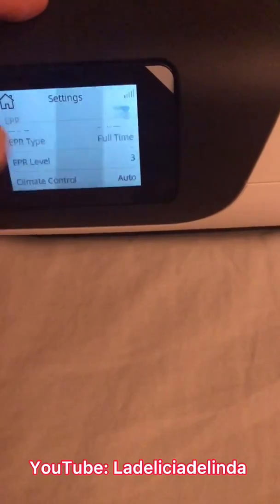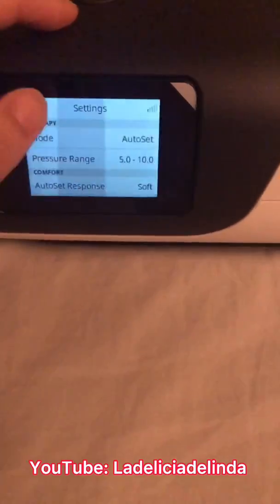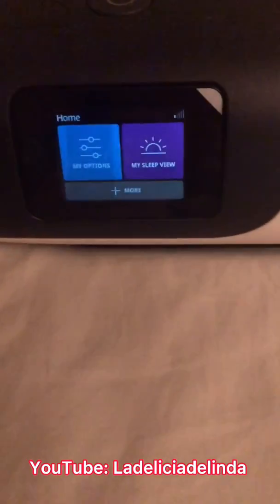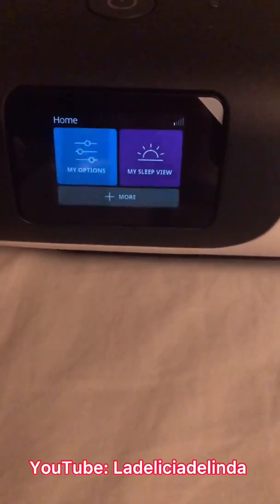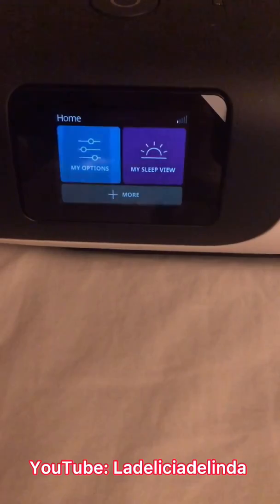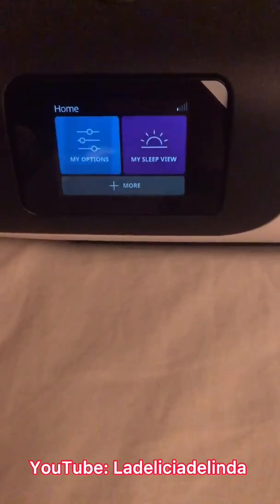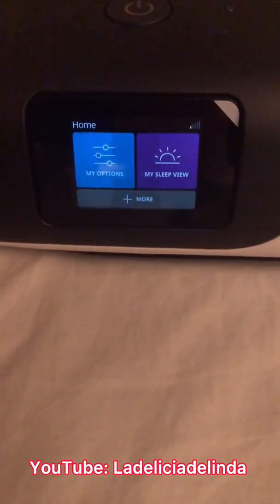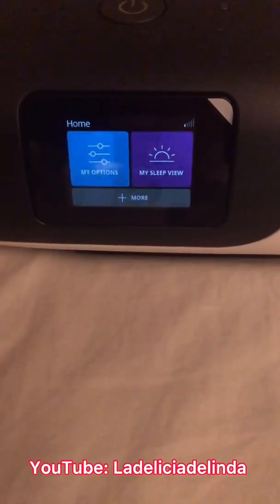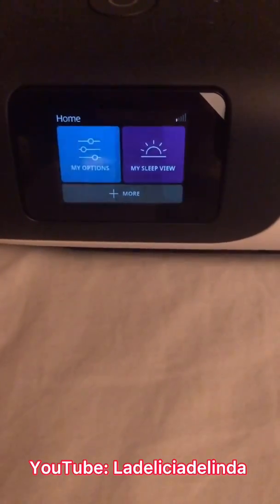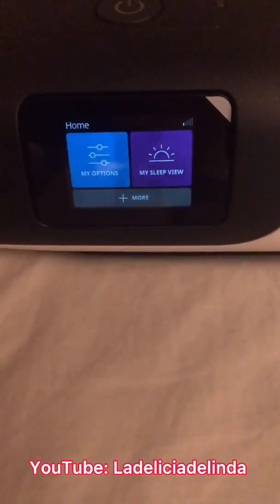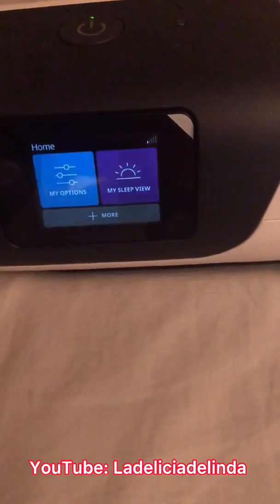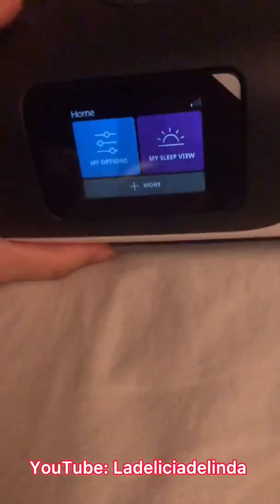Again, use the clinical settings at your own discretion. I wanted to show people how to access it because it is different from the AirSense 10 and older models, and also different from the Philips Respironics machines. As you probably know, Philips Respironics had a recall, so their machines aren't really for sale on the market unless you buy a used one.